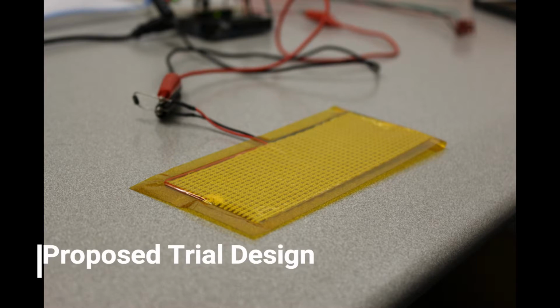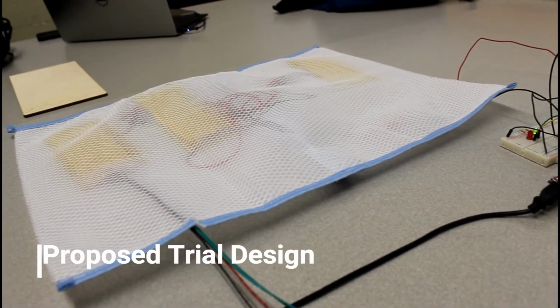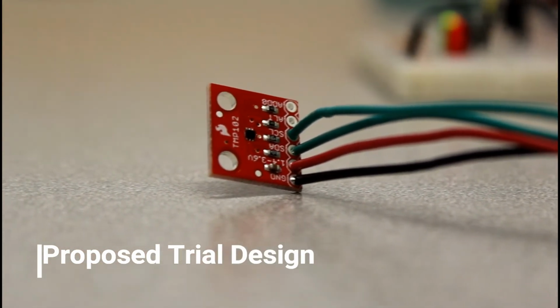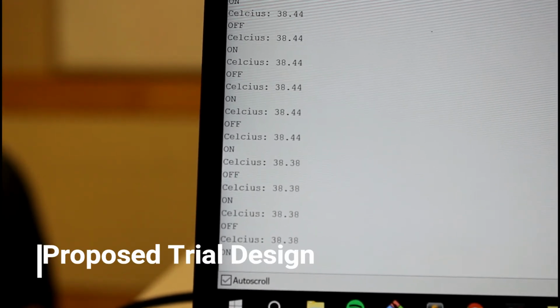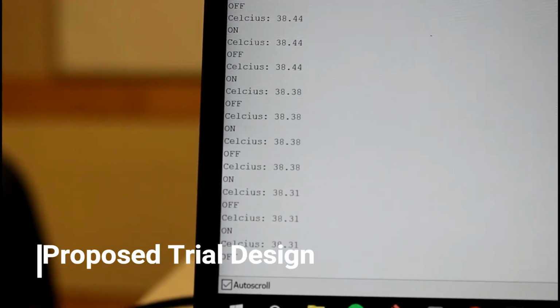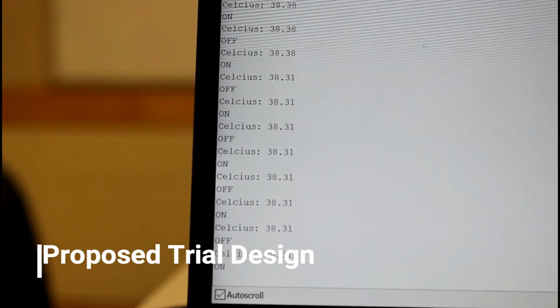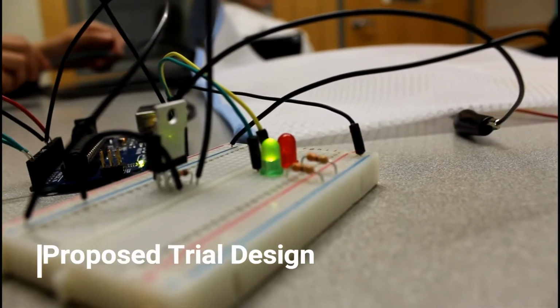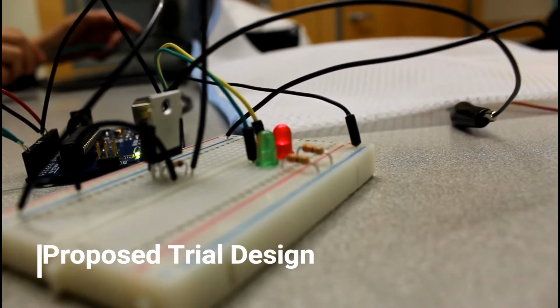This is the heating pad that is used to maintain the infant's body temperature. 3 heating pads will be spread throughout the mat to spread heat all throughout the infant's body. A temperature sensor will monitor the infant's body temperature. If the infant is too cold, the heating pad will turn on. If the infant is too warm, the heating pad will turn off. The temperature modulation will ensure that the infant's body temperature remains between 36 and 37 degrees Celsius. A green LED lights up when the heater is on, and a red LED signifies that the heater is off.